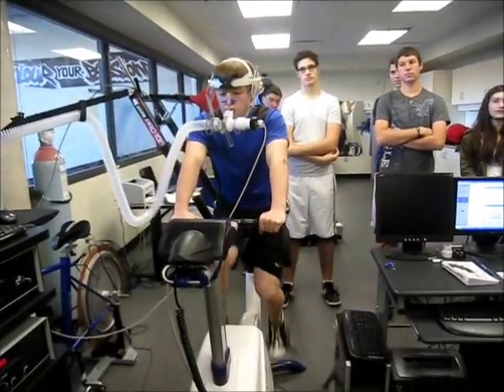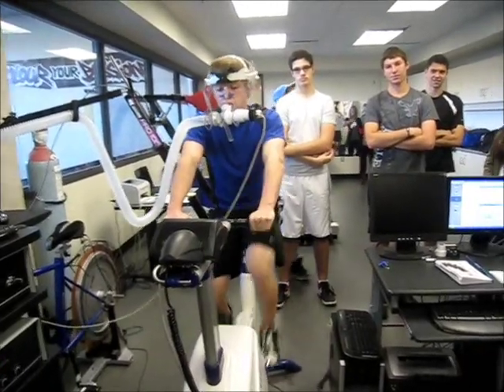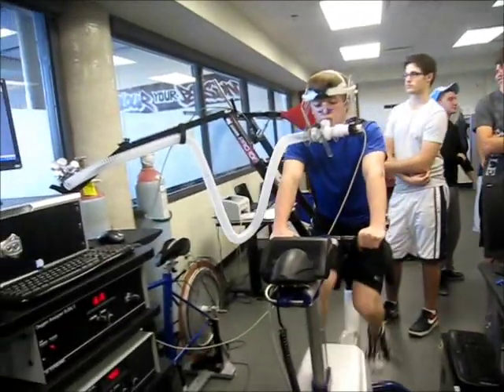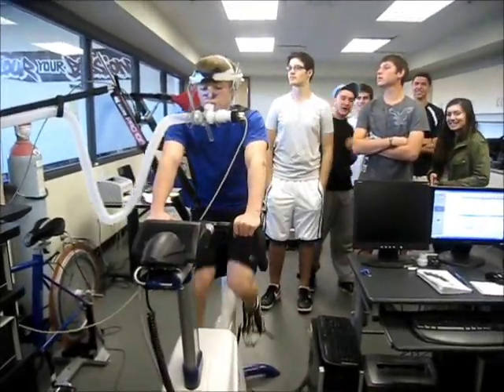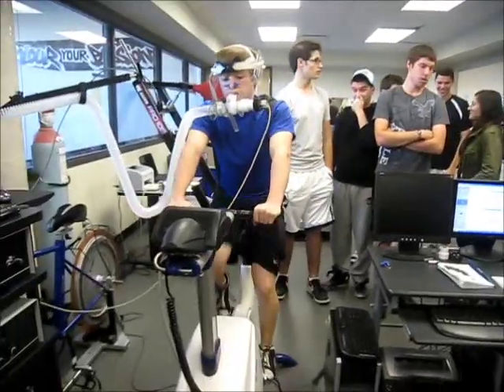He's at 175 watts — how are you feeling? You can see his volume of oxygen that he's taking in is going up, and that's because the ATP demand is going up in his body. The ATP demand is going up, so he needs to take in more oxygen — we're able to see that. And his heart rate's climbing as well, but ignore that dip there — that was a lost signal.